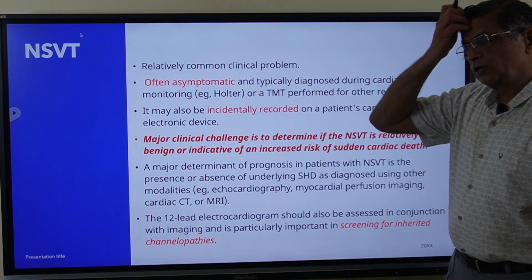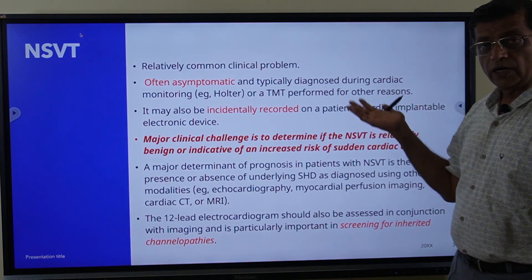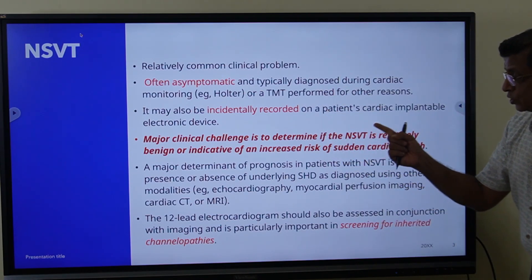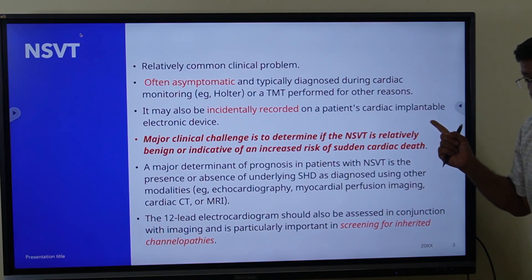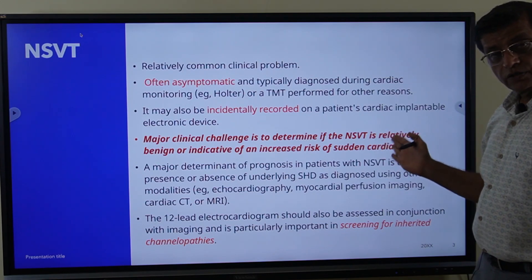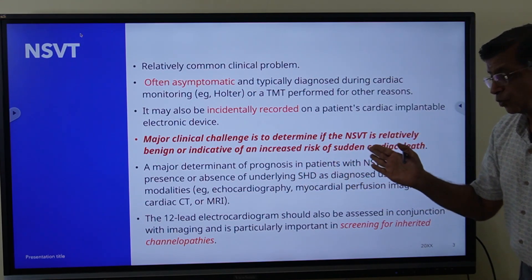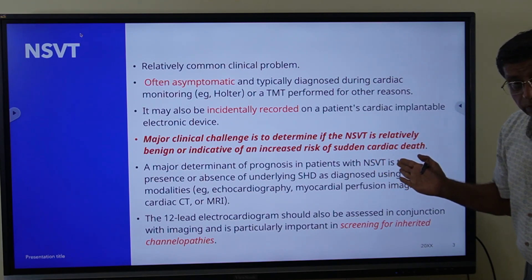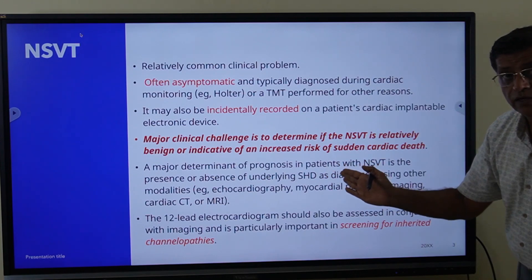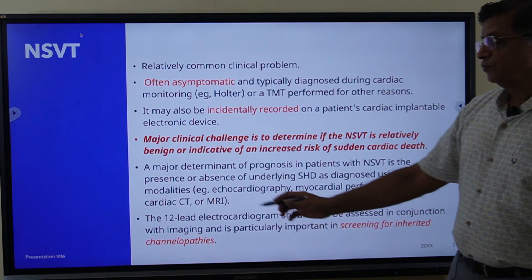The definition of non-sustained ventricular tachycardia: three or more consecutive ventricular beats, rate more than 100 beats per minute, and duration less than 30 seconds. This is a common clinical problem; mostly it is asymptomatic, typically diagnosed on a Holter or sometimes captured by an ICD device. The major clinical challenge is to determine if NSVT is relatively benign or indicative of increased risk of sudden cardiac death.